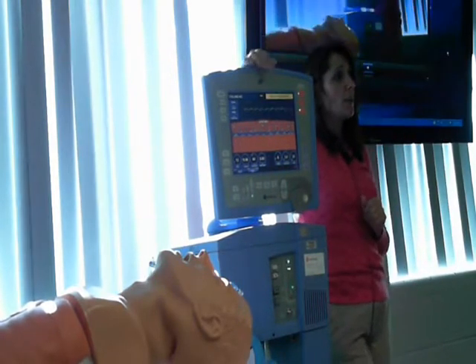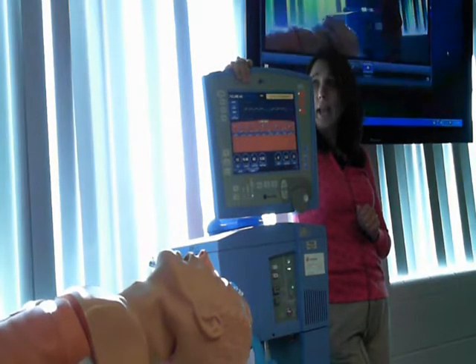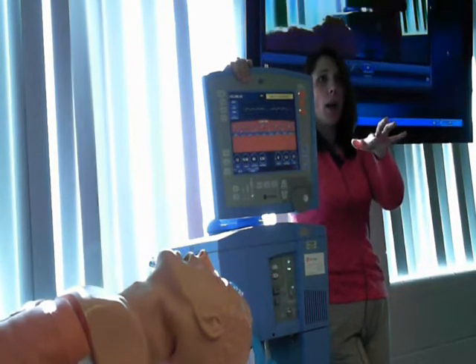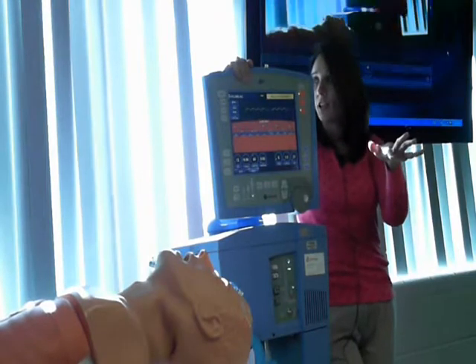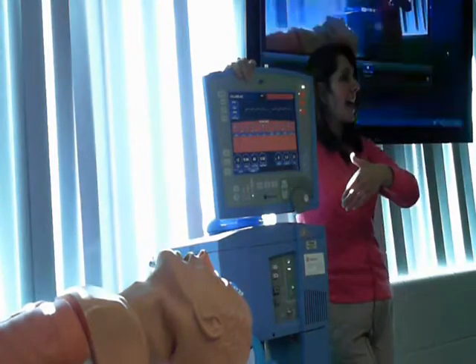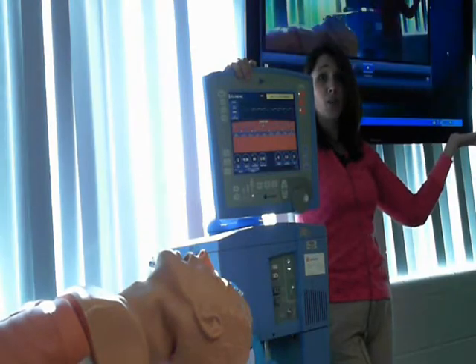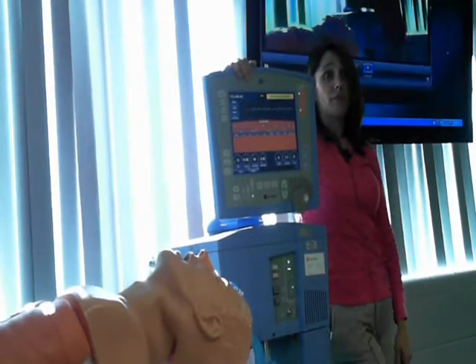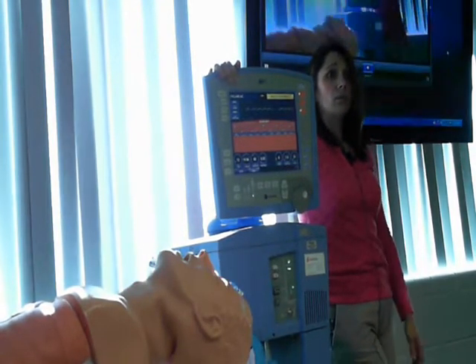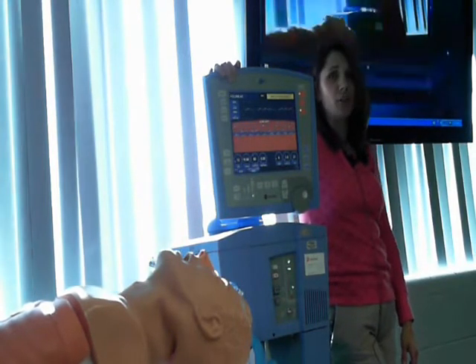But the reason I bring that up is, what if the patient's very anxious and they cannot handle being awake while being intubated? You all are going to have to give them pain relief and sedation so that they can tolerate this. What if you accidentally knock out their drive to breathe? Because you know all narcotics in a high enough amount can knock out the respiratory drive. What if that happens when they're on a vent in assist control? No big deal. Okay, we've got that covered.